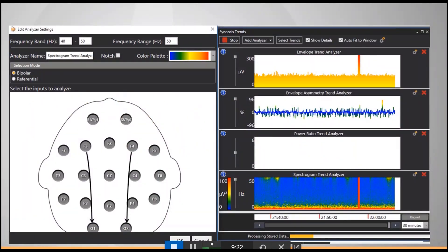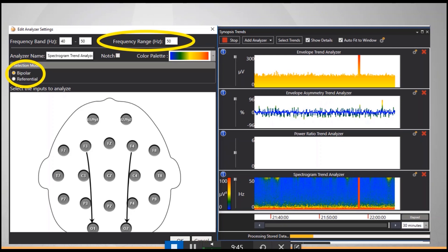In the spectrogram, you can adjust several settings: the frequency range — that's the 0 to 50 hertz scale — the electrodes you select (whether bipolar or referential and which specific electrodes), and of course the time scale. There's also something called the frequency band setting, which relates to a white line that allows you to show the band power overlaid on the spectrogram. If you just want to look at the spectrogram, you can pretty much ignore the frequency band selection.